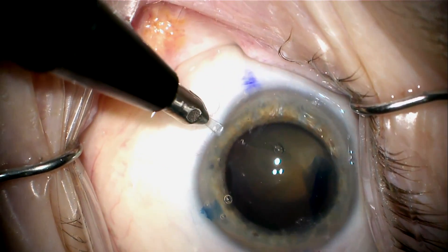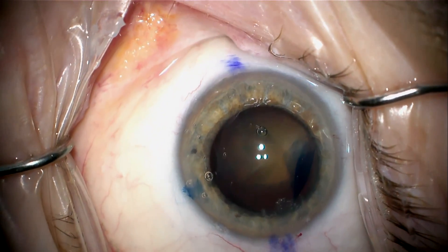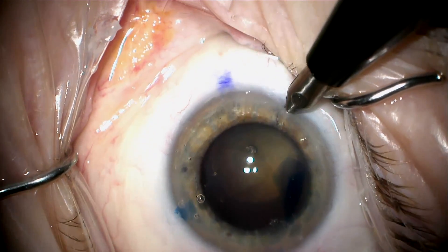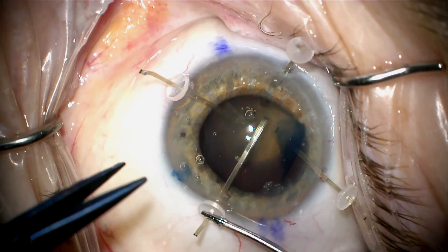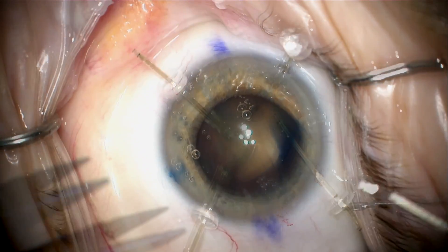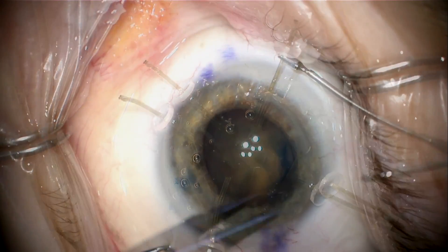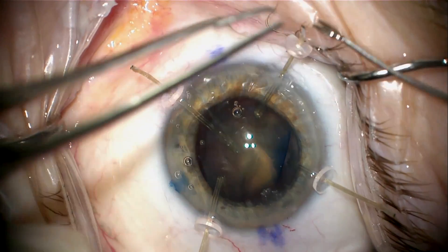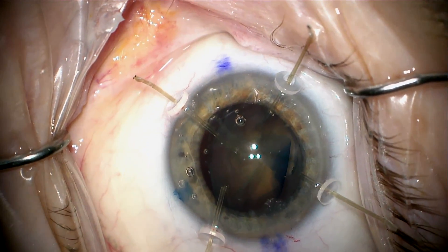The capsulorhexis is now completed, and I'm going to place my capsule retractor. I use this 0.7-millimeter diamond blade angled downward at about 30 to 40 degrees. That matches the angle on the capsule retractor so that the retractor will come in parallel to the anterior capsule and end up in the recess or fornix of the capsular bag, rather than pulling up on the anterior capsule, which would be the case if the paracentesis were parallel to the iris. By angling it down, it keeps the lens in its physiologic position.